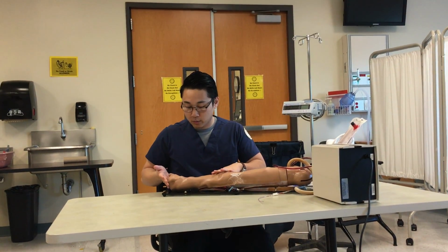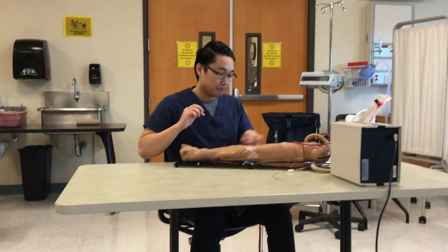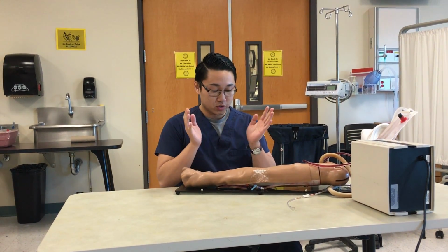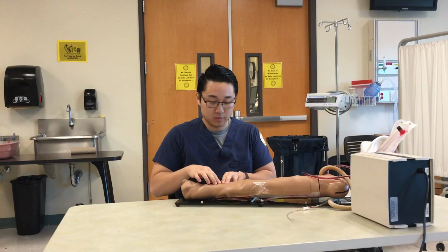So this arm is the right arm, and I choose to do it on the radial artery. There are also the femoral artery and the brachial artery I can do the stick on. So for each artery, I will have to stick the patient at a different angle. For the radial artery that I'm doing, I'll stick it at a 45-degree angle. For a brachial artery, I'll stick it at a 60-degree angle. And for the femoral, I will do a 90-degree angle.